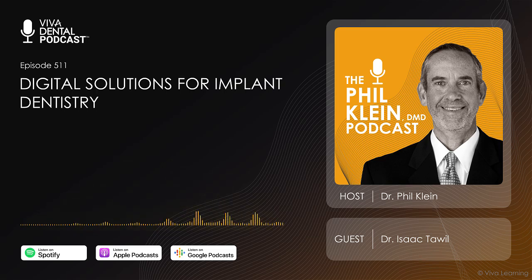And intraoral scanning was out while I was in dental school. Go back to the CEREC red cam and blue cam, but it wasn't really at the level where a practitioner could utilize it in any kind of meaningful way, unless they were going to take a whole day to make a crown and scan a patient. Typically, people would just rather have a standard impression, and then you could digitize that.